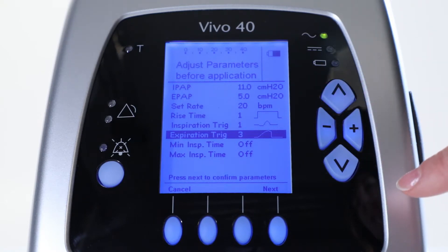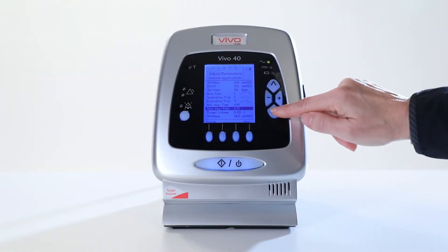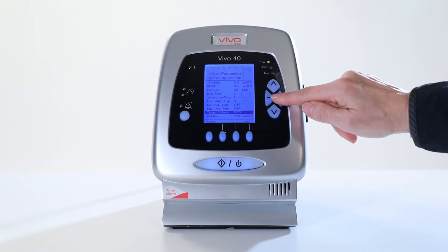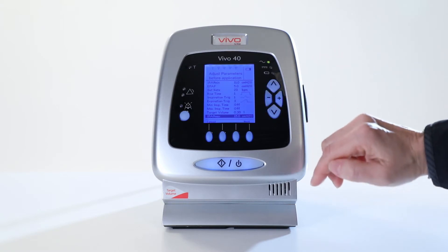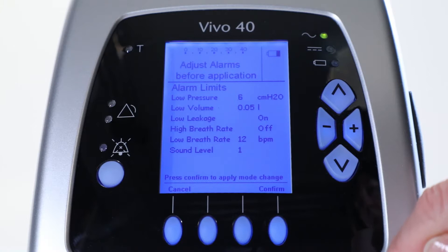Then, let the minimum inspiration time be off. Do the same for maximum inspiration time — let it be off. Next, you adjust the target volume to 300 milliliters and the iPAP Max to 15 centimeters of water. Press Next to confirm the parameters.